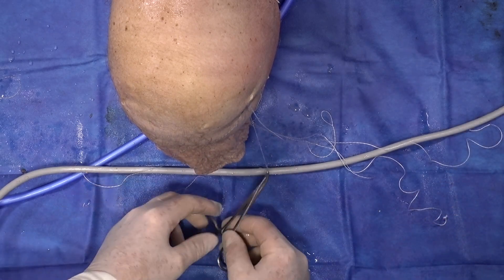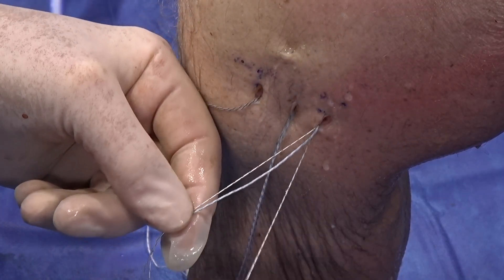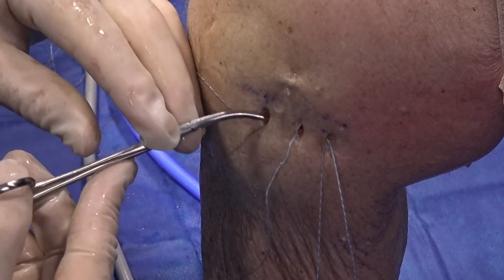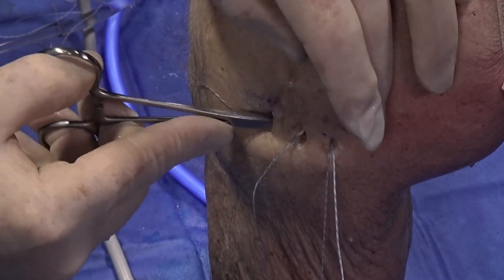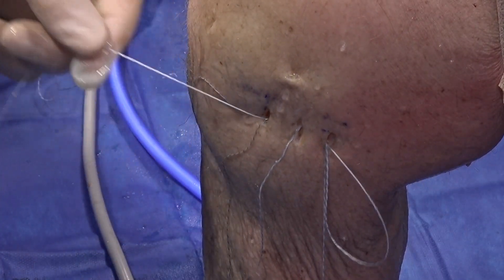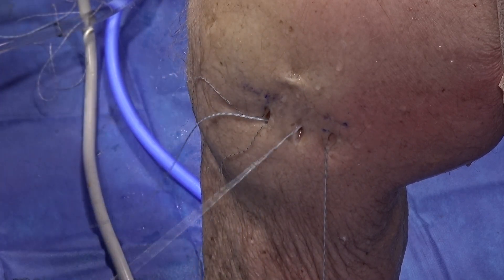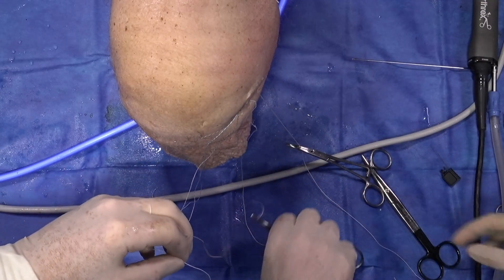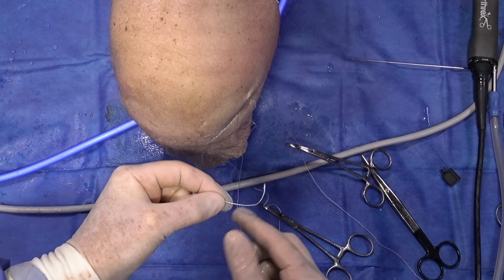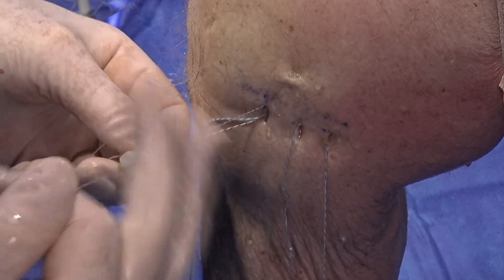We then do the exact same step to link the middle repair suture to the posterior anchor. Next, we take the posterior repair suture and bring it all the way across from the posterior incision to the anterior incision under the subcutaneous bridge, linking it to the anterior anchor in the same manner — just as we linked anterior to middle and middle to posterior.